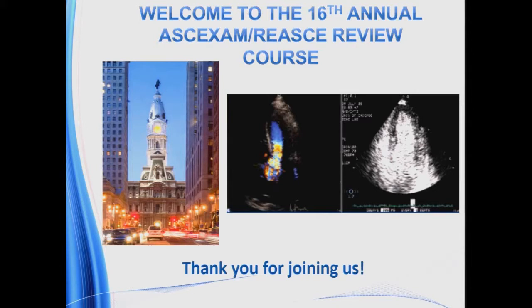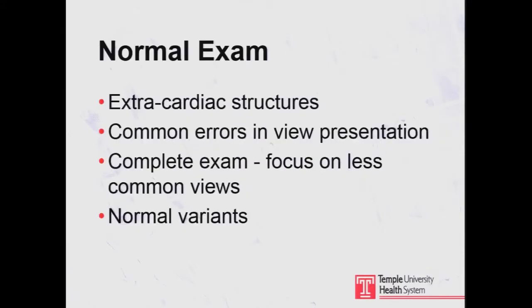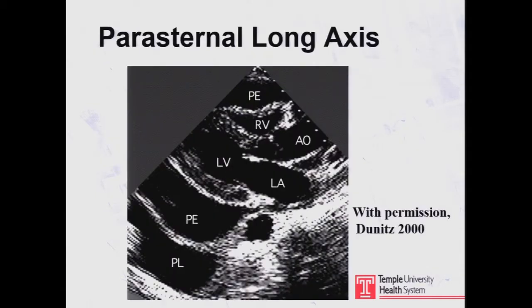The argument is that most of the literature measured M-mode measurements and related them to when to operate on aortic dilatation. In addition, CT measures the entire caliber of the aorta, which is more leading edge to leading edge, and so that's recommended.